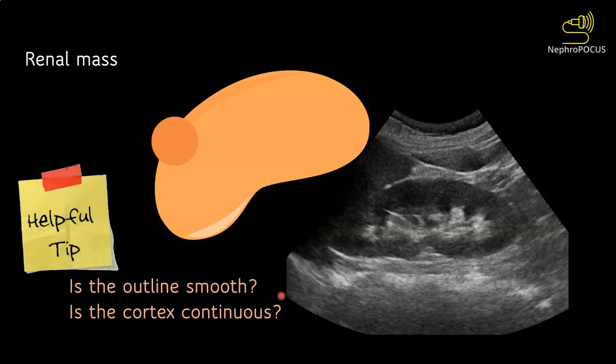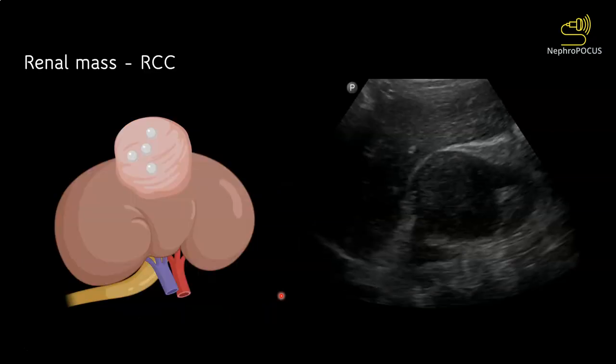The first question is: is the kidney outline smooth? Because most masses tend to grow outward, disrupting the outline of the kidney — meaning the kidney changes from its normal bean shape to something else. The second question is: is the cortex or the renal parenchyma continuous? Because masses usually cause a disruption or discontinuous nature of the parenchyma.